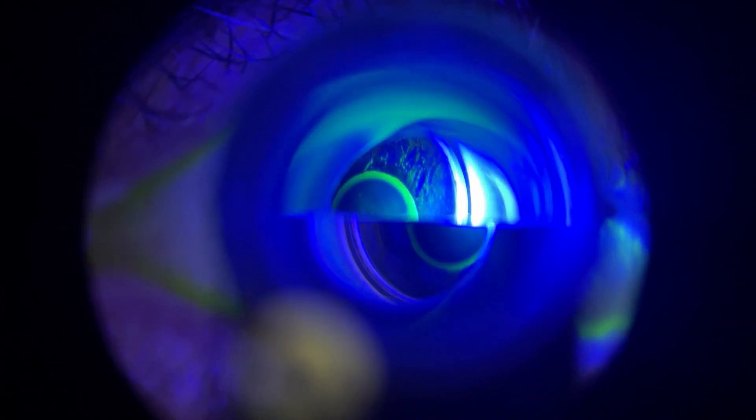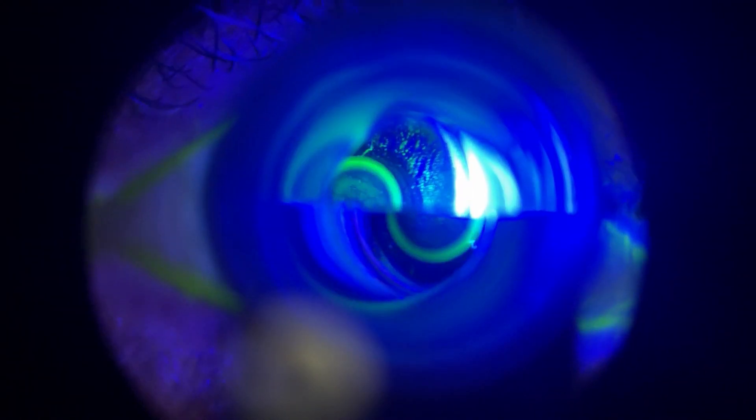There are a couple of ways you can cause yourself problems. One of them is not touching the cornea correctly. If you touch the cornea too little, the measurement is wrong. If you touch it too hard, the measurement is also wrong. There is a certain range where you feel like the two circles are kind of locked in — you have to find this range. Just slowly touch the cornea and move forward a bit until you feel it's completely locked in. If you move further, you'll start to see movement again.